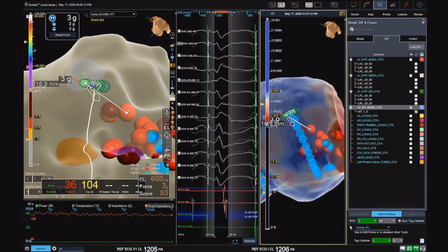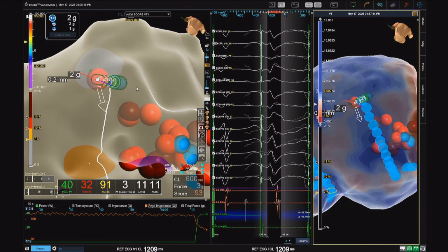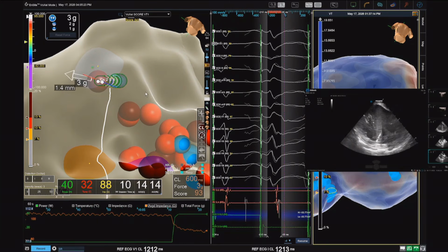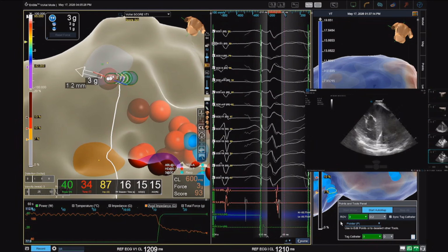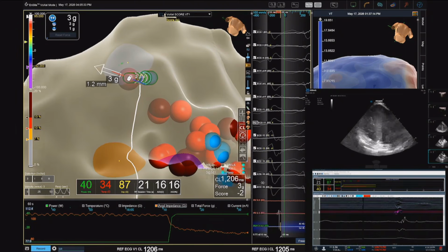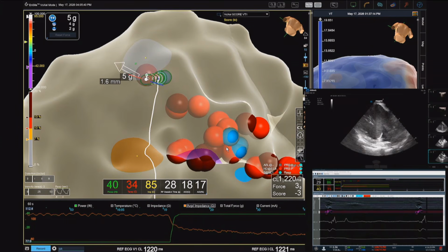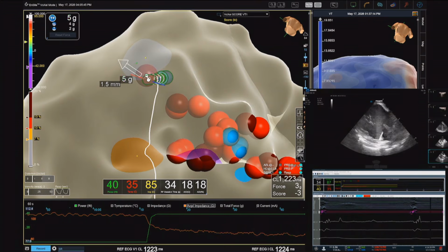Okay, let's see. Very important lesson: if using RF, these applications should be longer. It's not thin tissue. If you want to reach deeper with RF, the applications have to be longer because it's the conductive heating that creates the lesion. So you generally need to wait 60, 90 seconds sometimes, to get deep enough. If you do very short lesions, even with a high power output, they're probably very shallow. Yeah, signals have decreased in amplitude, but they have not disappeared. Can you zoom in, Maria, please, the CT?